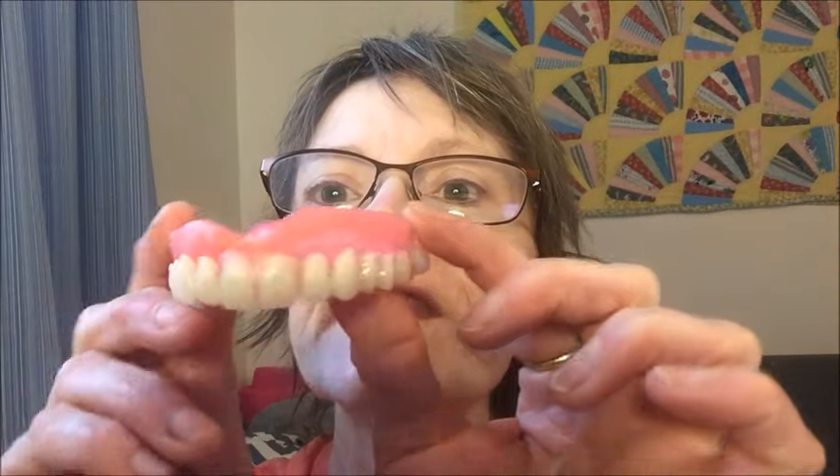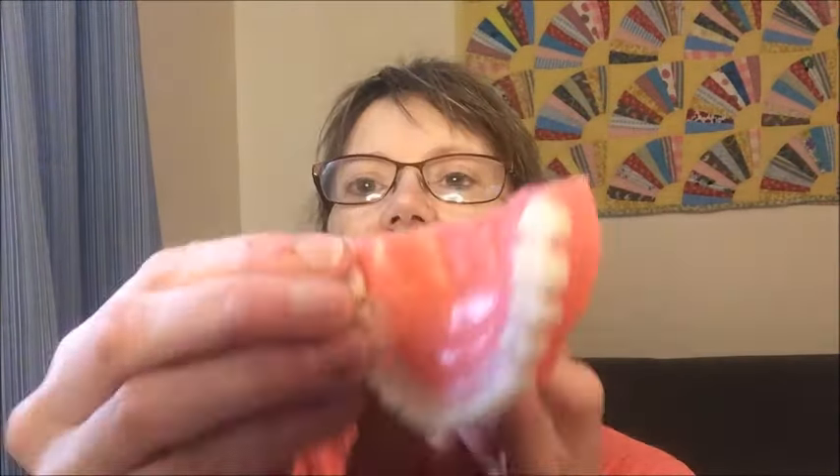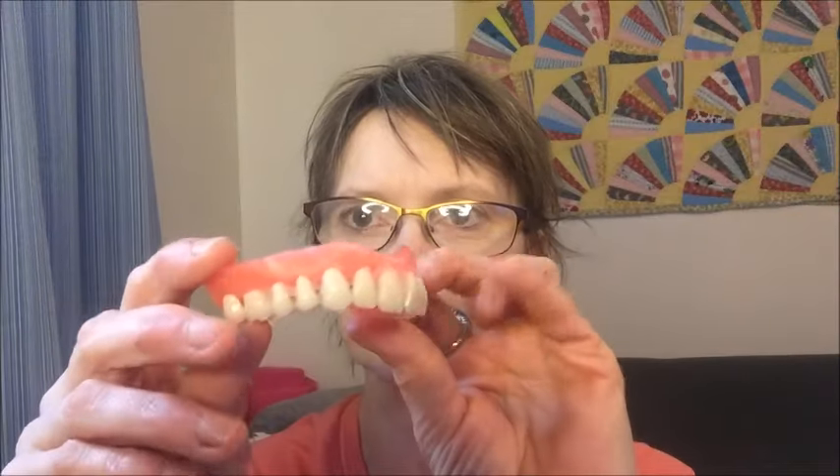Hi everyone, Crafty Lori here. I just wanted to give you an update because I have decided I am going to make my own dentures. This is a denture that isn't finished — this was a practice denture made out of wax, and these are just some costume teeth I used because I didn't want to use the real set I bought. I haven't really set the teeth in yet, but I'm pretty confident I can move on to making a real denture.